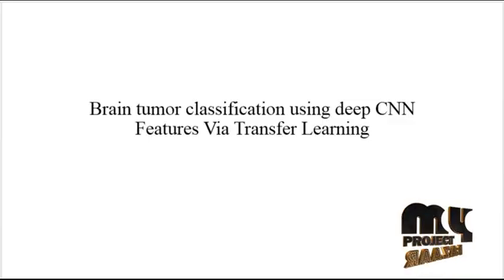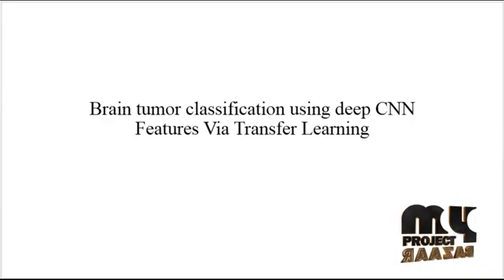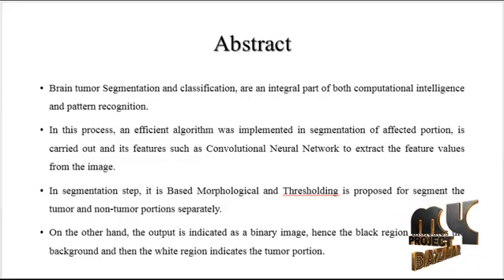Welcome to myprojectbazaar.com. Now we are going to discuss the product, brain tumor classification using deep CNN features via transfer learning. Now we are going to discuss the abstract of the process.